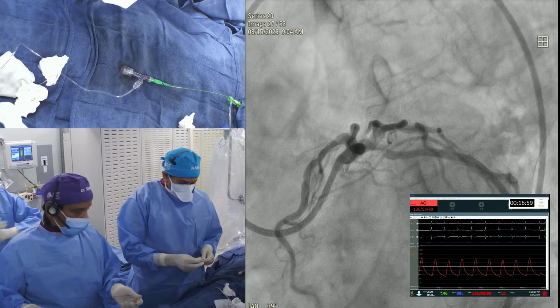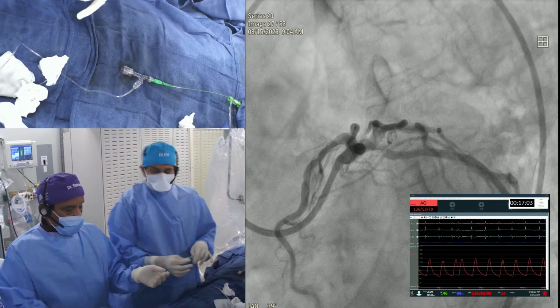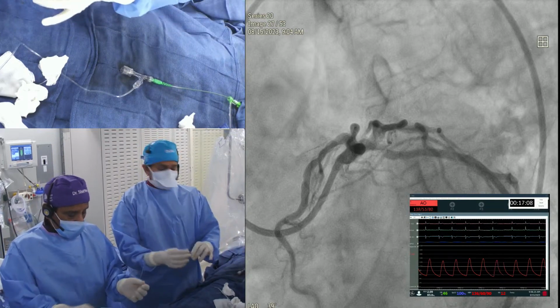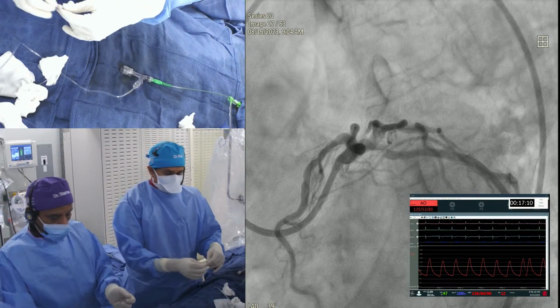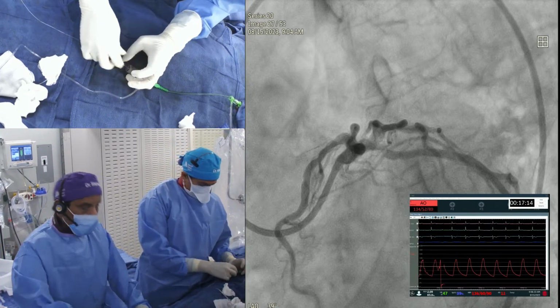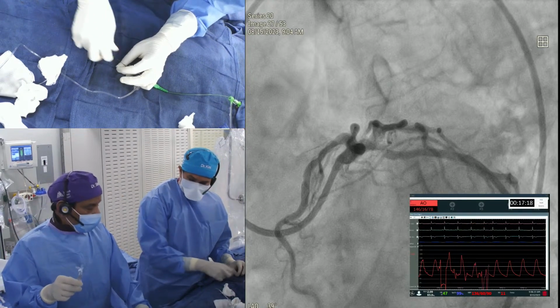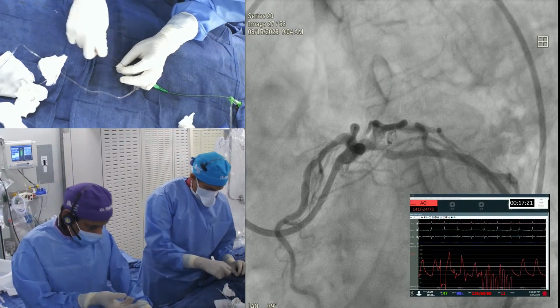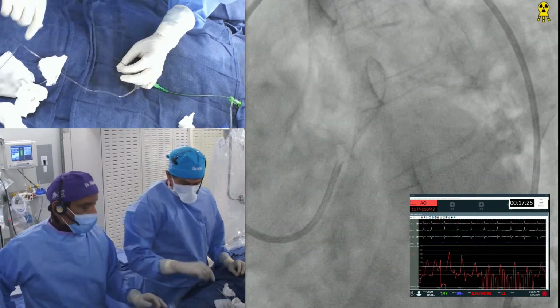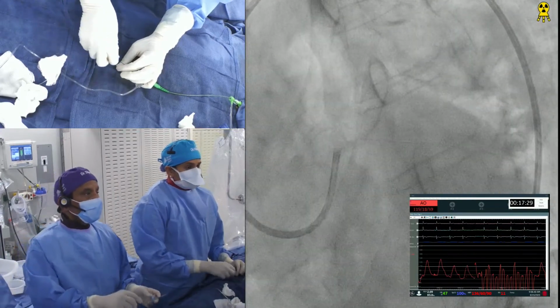Any questions? A lot of the trials will be presented at the European Society. The biggest thing we are waiting for is ILUMIEN 4, which will be presented at the European Society, I think on the 28th or so of this month. That's comparing OCT-guided versus angiography-guided PCI in complex lesions. Ziad Ali will be presenting that, so everybody is keeping an eye on that trial. So this is now the 3.5 by 16.